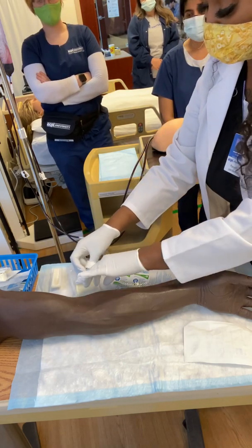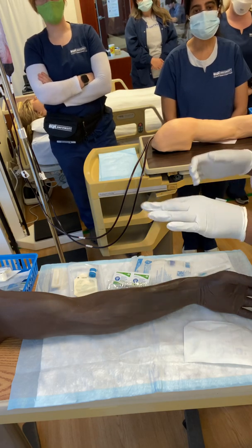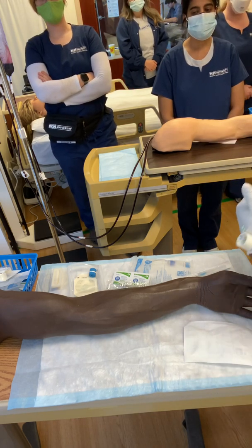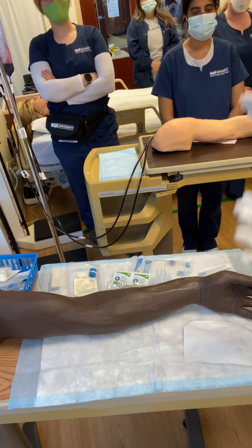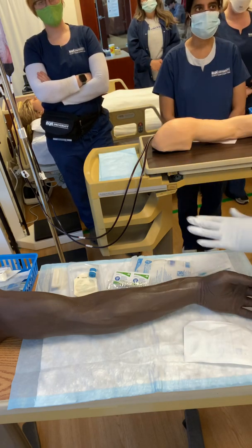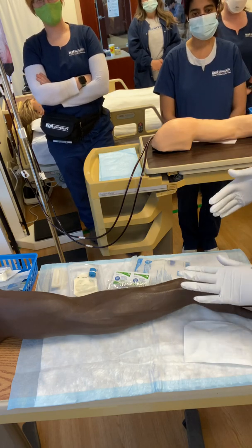All right, now we got our tape ready, okay? So I like to get our tape ready and like to put it right there in my hand. A lot of people like to put it on the side of the bedside tables. That's a source of infection for me, so I don't do that. In the nursing field, a lot of people do that. But, you know, it's a source of infection when you're putting tape onto a bed and then you're putting it onto a patient. Think about if that's not properly clean. You're introducing infection and microorganisms, okay?